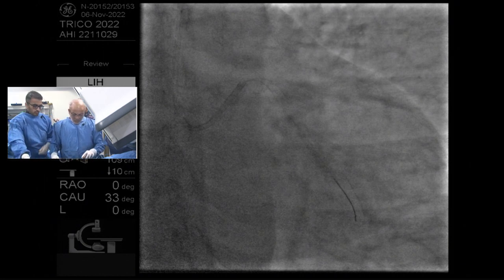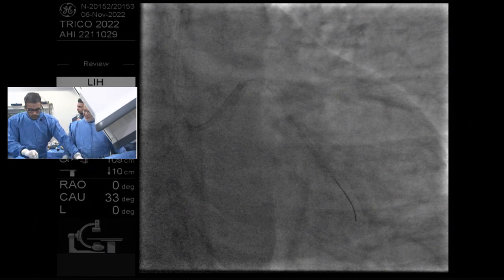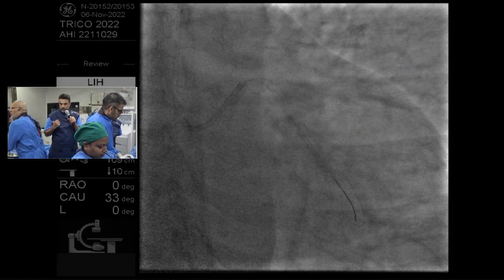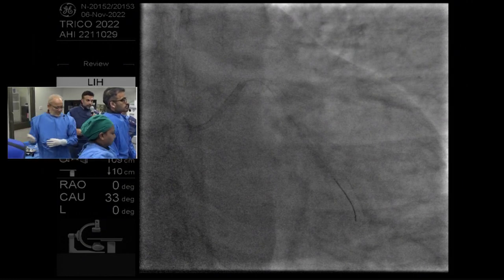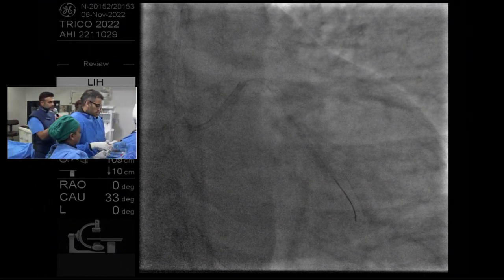And in the meantime, you can get a 2.0 compliant balloon as well because that'll be your pre-dil balloon. 2x15 really? Sure. 2 or 2.25 or 2.5, whatever. It's a plenty big vessel to accommodate any of those things. No. 2x15. Perfect.